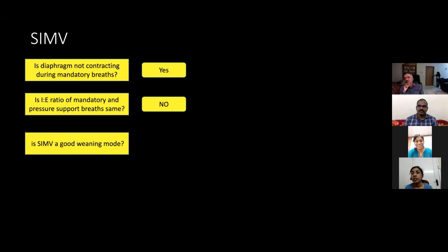No, sir. Why? It increases the work of breathing, it causes diaphragmatic injury, and it will be difficult. It takes more time to breathe. Yes, understood. So always go from volume control, pressure support, or pressure control, pressure support, and wean.